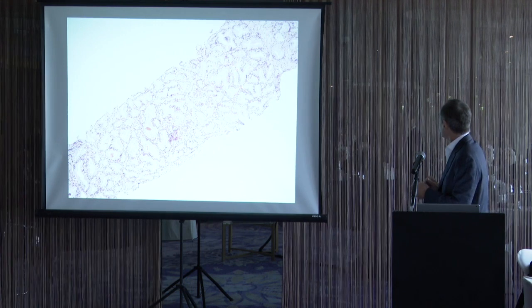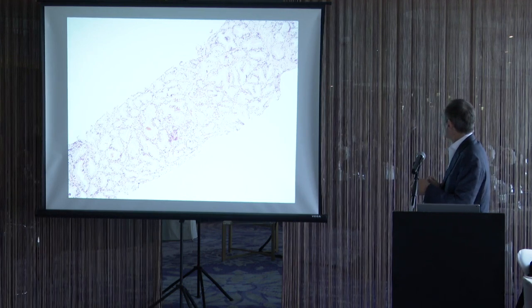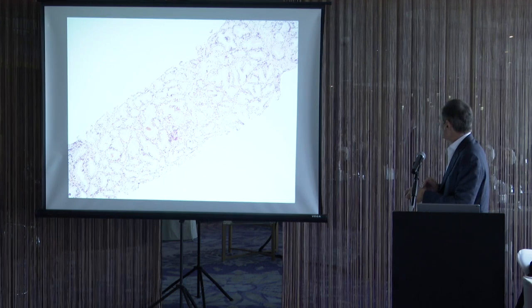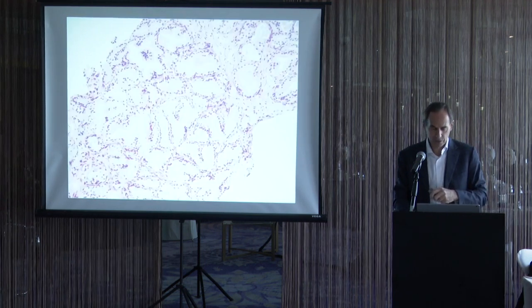some branching. These could be maybe a little papillary infolding here. This looks like it could be more crowded benign glands. Down here, it looks maybe more like it could be cancer. But as we'll see, all of these glands look identical and they all merge together. And that's what you get with adenosis.